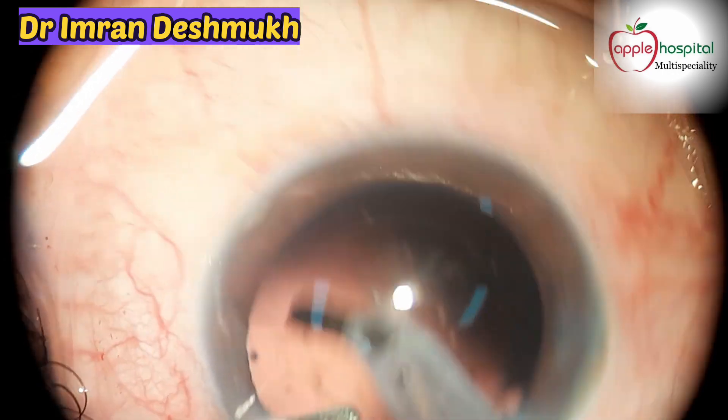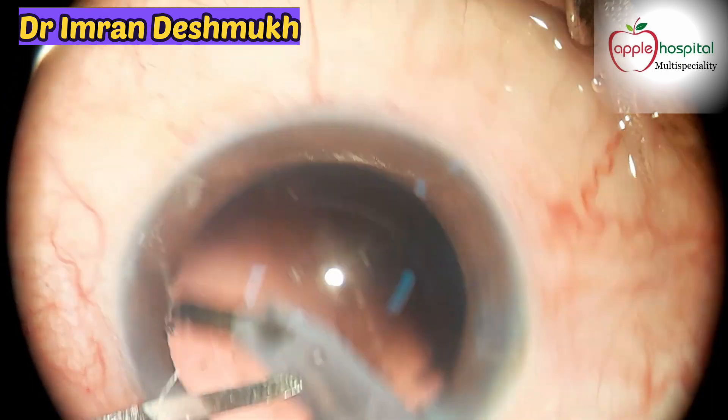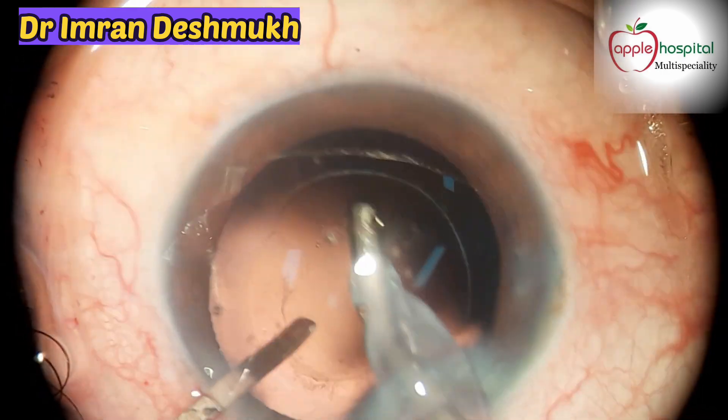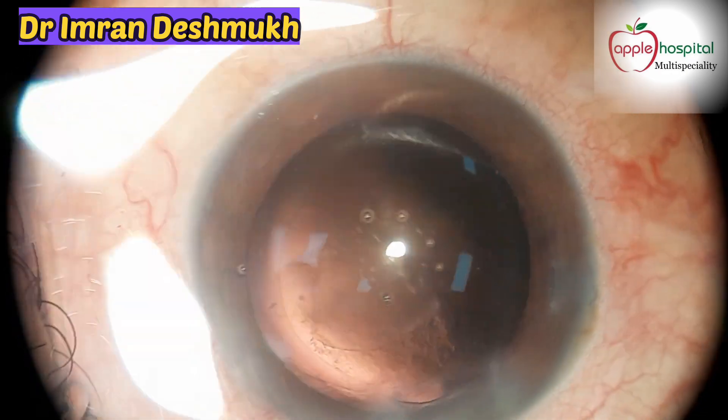Now it's time for polishing the posterior capsule. That's pretty fine, that's nice, that's looking neat. The polishing is done.